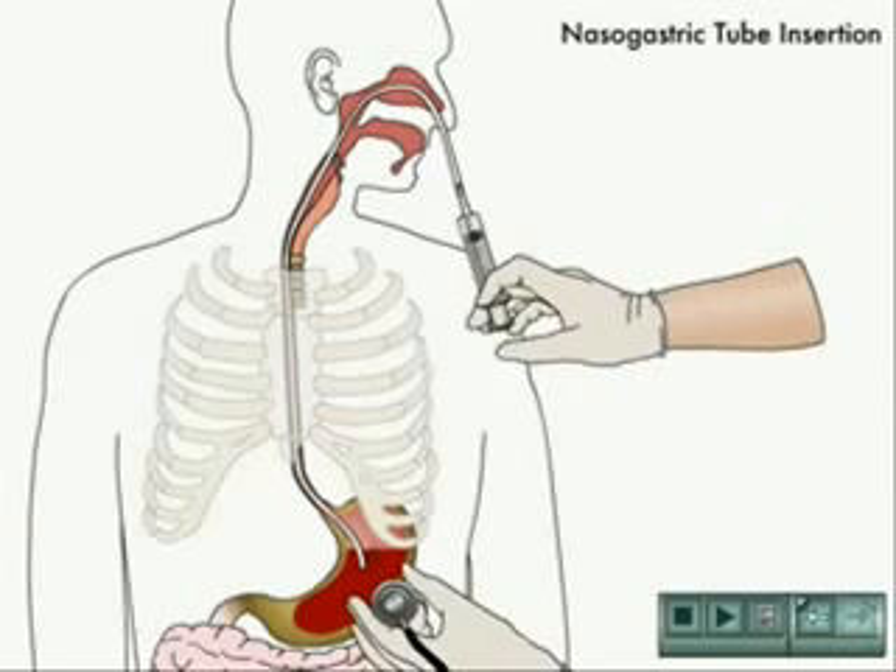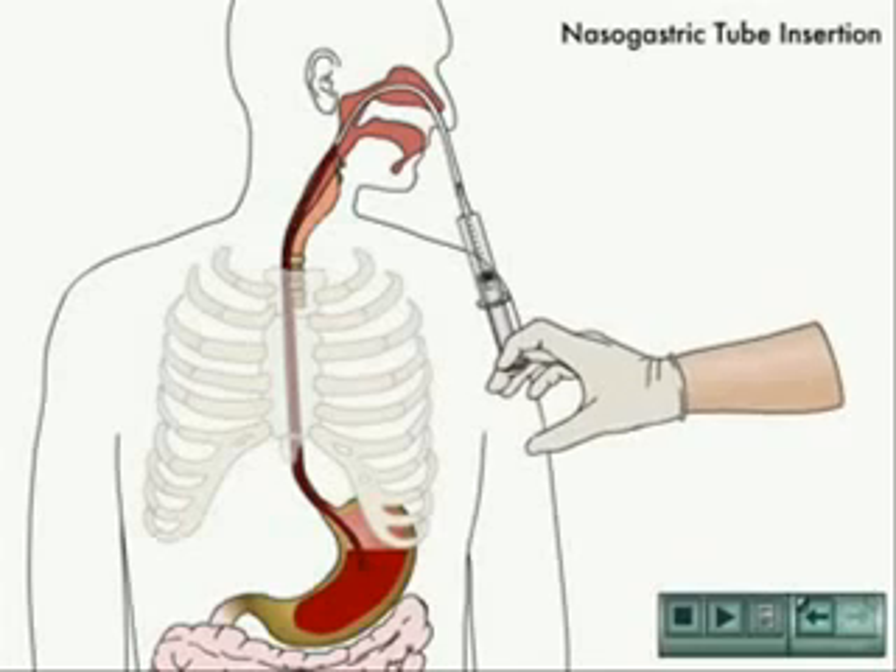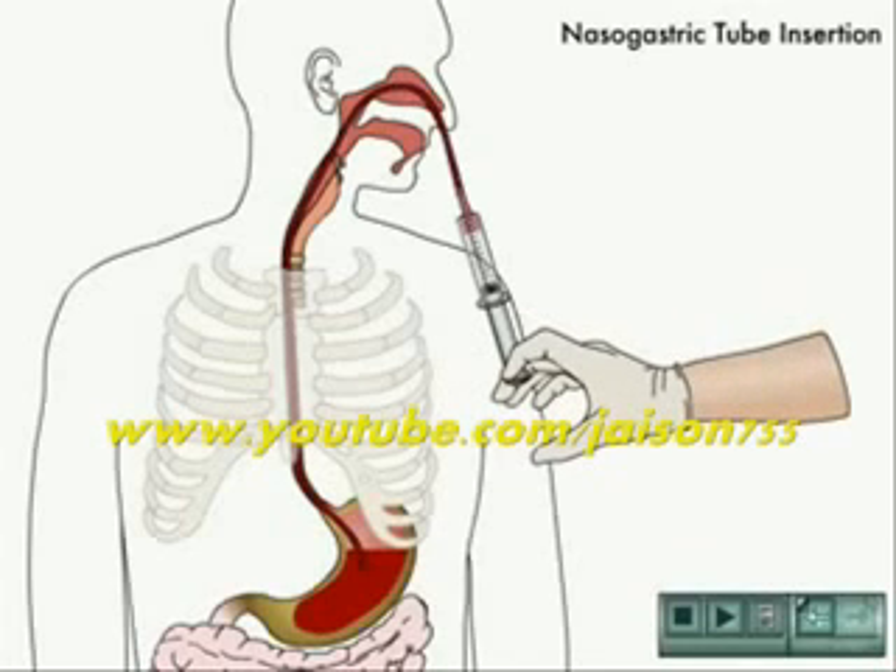The tube tip is lubricated and then passed into a clear nostril. A pin light is used to inspect the back of the throat to ensure that the tube is passing into the esophagus rather than coiling up in the mouth.